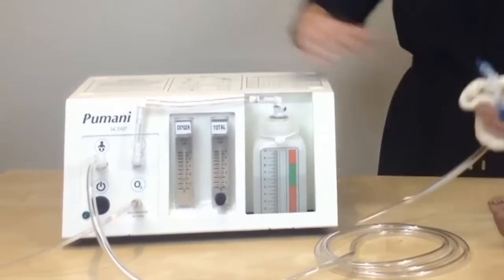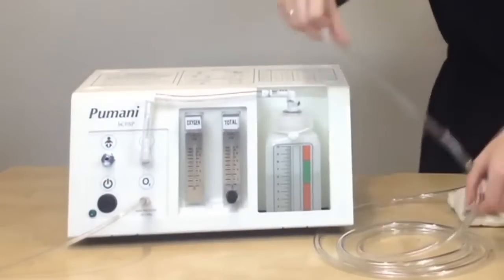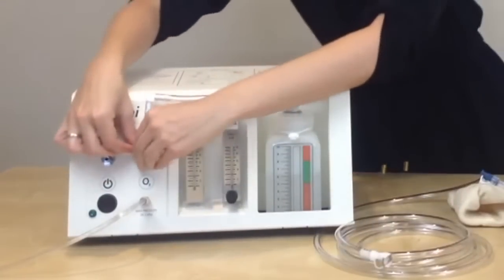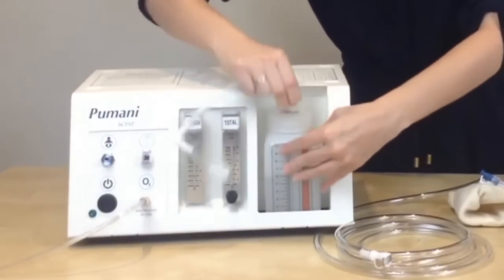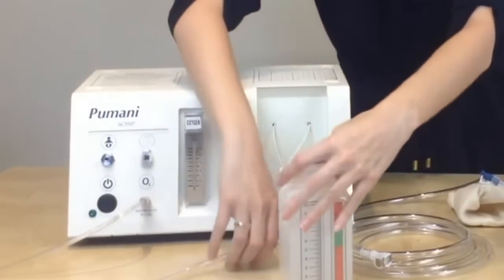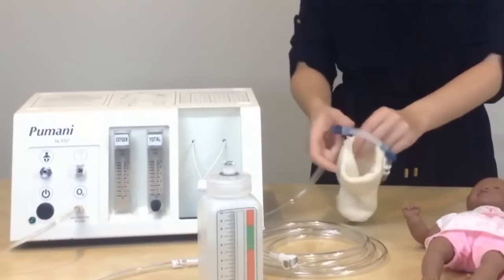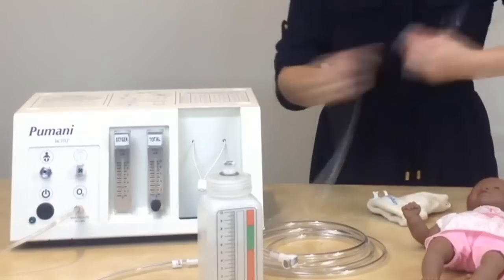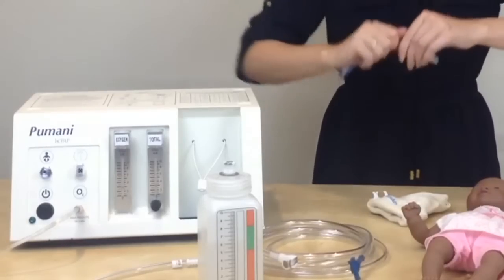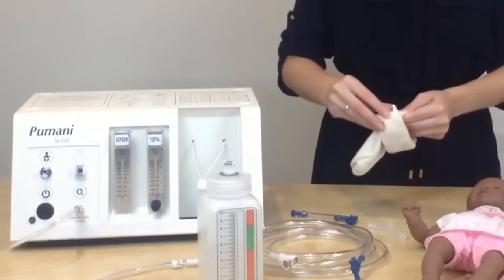Then you will take apart the tubing: detach the patient tubing, detach the bottle tubing, and the bottle. Then you will take apart the nasal prongs, the end cap, and remove the hat clips from the hatches.